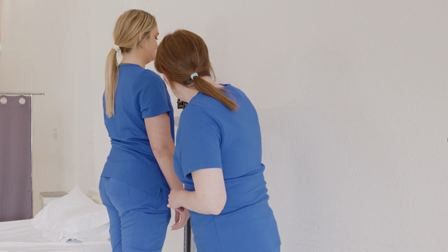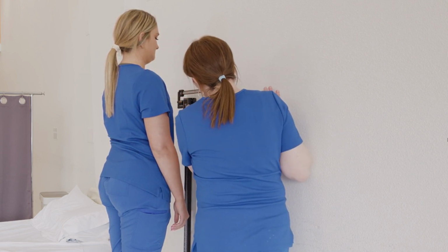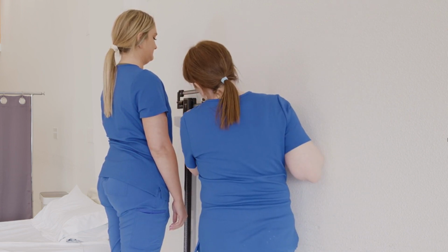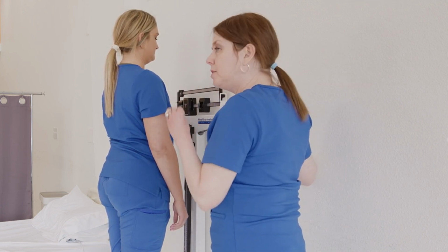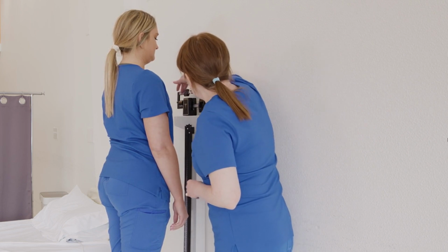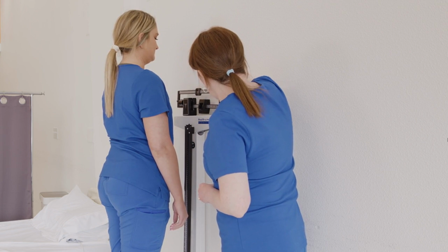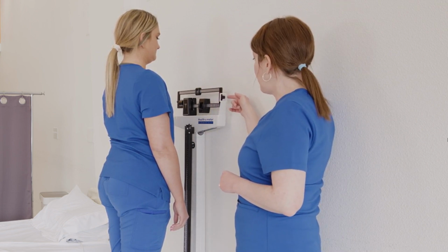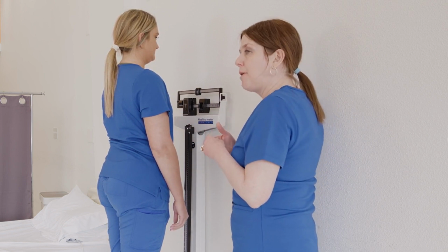So I'm going to keep moving this block along by 50-pound increments until it drops to the bottom. When it drops to the bottom, I'm going to slide back to the previous number, and then I will fine-tune my weight by sliding the block along at the top until it's floating right in the middle of the square. It's not touching the top of the square or the bottom of the square. At that point, I'm going to get my patient back to safety.